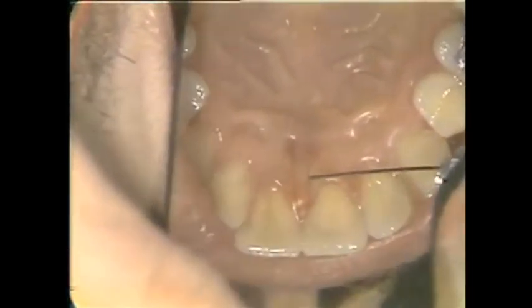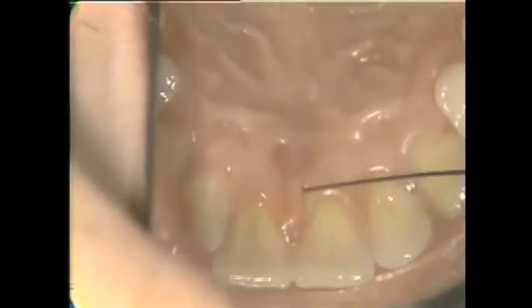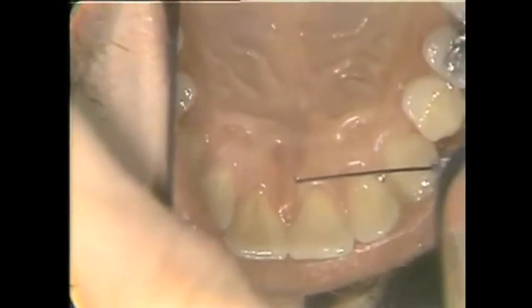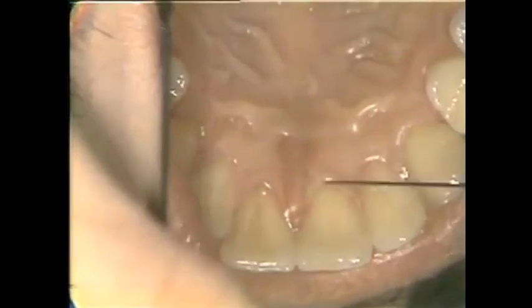All right, we have our needle bevel against bone, and I have aspirated. And now, as you see, as we depress the plunger, you can see the papilla blanch and the adjacent surrounding soft tissue. So we know that we're getting solution out into the area of the incisive foramen to block the nasopalatine nerve.